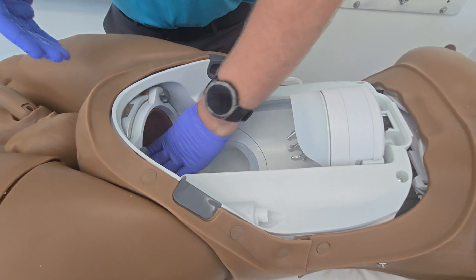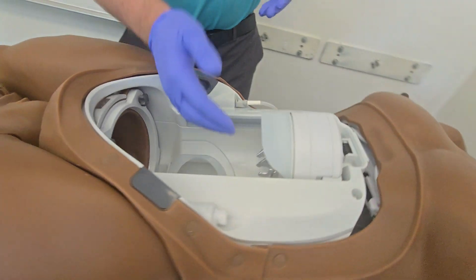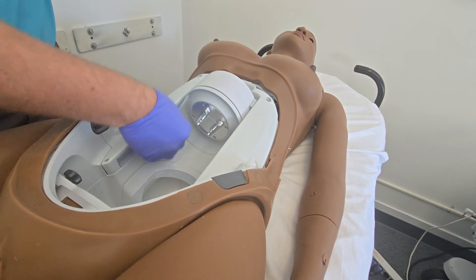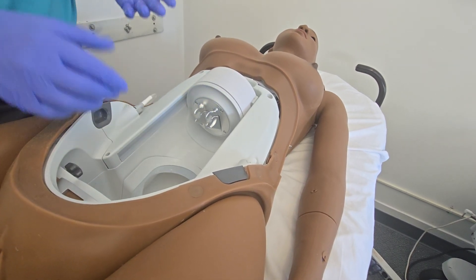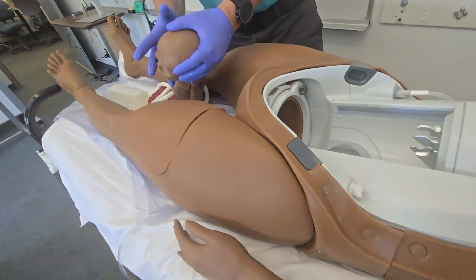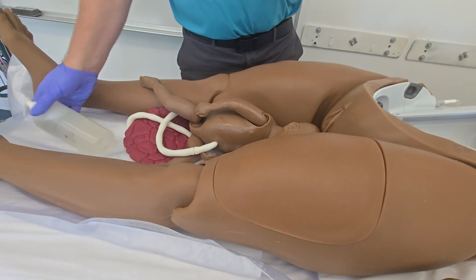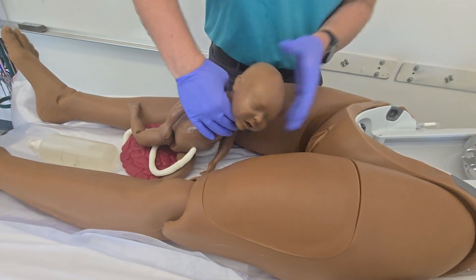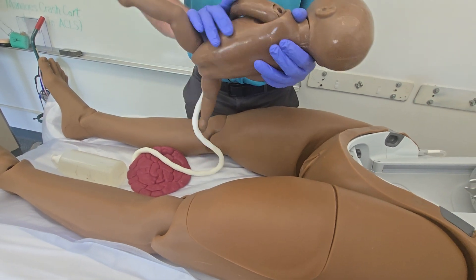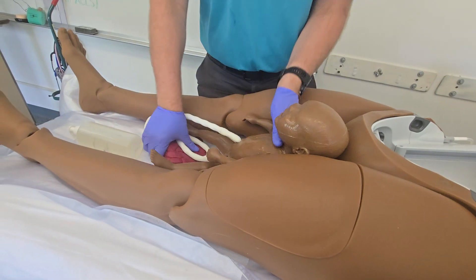We're going to lubricate up the perineum and some of the other areas. You can also lubricate this scoop — that's where the legs will sit. I'm actually going to rotate that to the bottom, which makes it a little bit easier for the baby to be loaded. About a quarter size at a time is a pretty reasonable amount — the size of a quarter in your hand — so that you don't waste any lube from runoff.